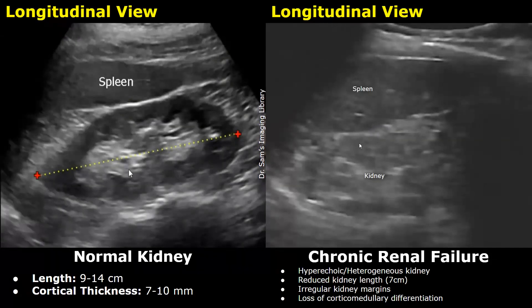This image shows chronic renal failure in the left kidney. It appears very small and heterogeneous, with hyperechoic areas. The hyperechoic appearance is due to the formation of scar tissue in the kidney.